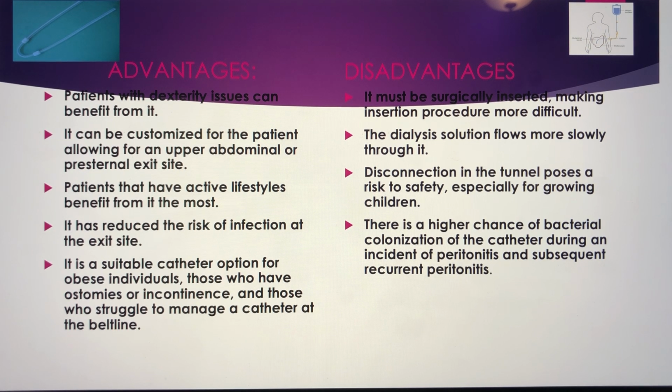Patients that have active lifestyles benefit from it the most. It has reduced the risk of infection at the exit site. It is a suitable catheter option for obese individuals, those who have ostomies or incontinence, and those who have struggled to manage a catheter at the belt line.